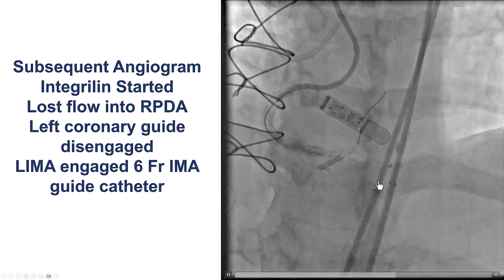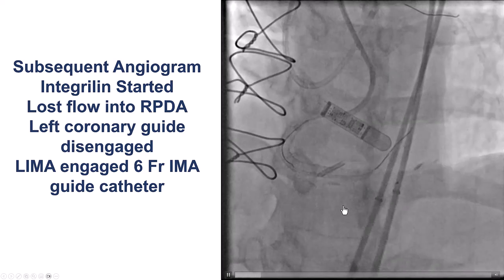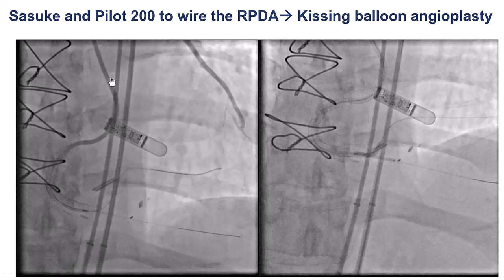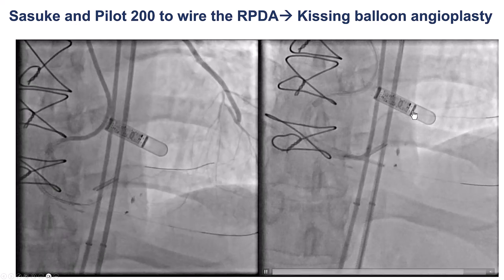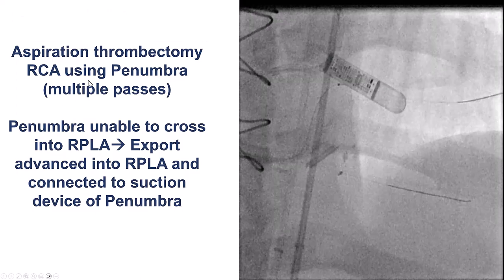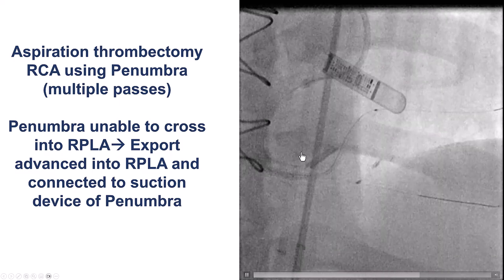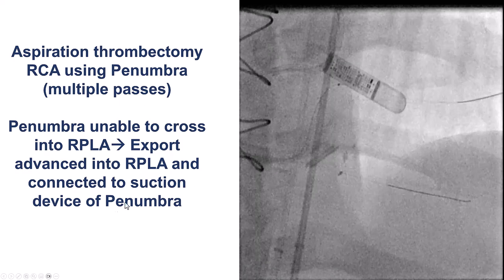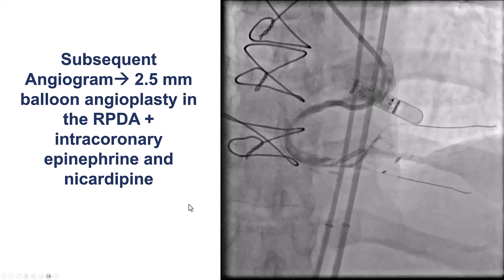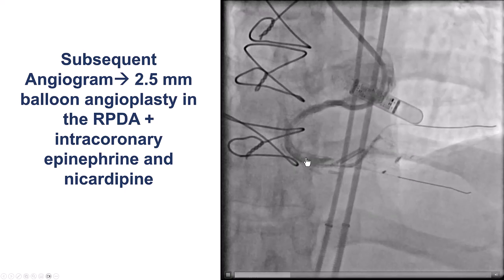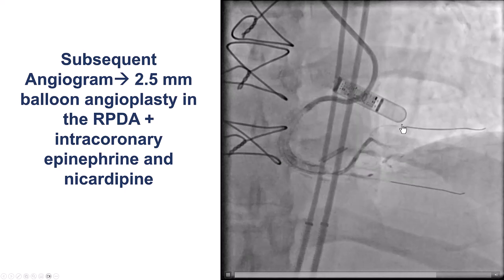There was no antegrade flow all the way to the PDA and to the posterolateral. We used a dual-lumen microcatheter as a circuit to wire into the PDA, then did a kissing balloon inflation distally. We used a Penumbra device, which is usually our go-to for large thrombus burden, doing multiple passes that retrieved some thrombus. We also used an Export catheter going all the way to the posterolateral using suction power from the Penumbra pump. Afterwards, the angiogram was a little better with some antegrade flow, but still a huge filling defect in the distal RCA stents and occlusion of the right posterolateral.